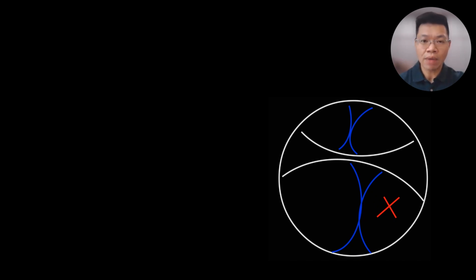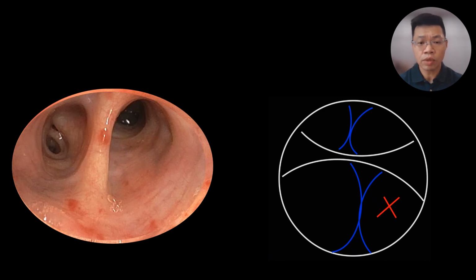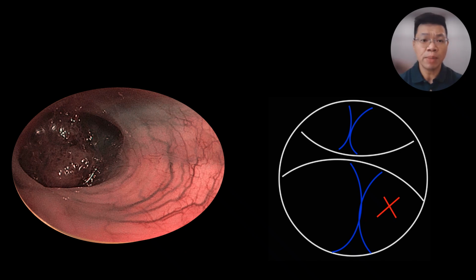Now we can follow our airway map into the middle lobe. As we go into the middle lobe, we can see the branching which we have drawn. And we know that we have to follow this inferior hole. And when we go inside, we can see again that there's a left and right split. And if we were to go into the right hole, we already can find an endobronchial tumor as expected, which appears with a malignant dot pattern on narrowband imaging.